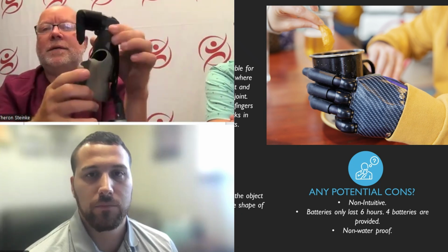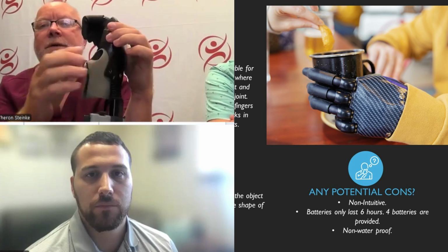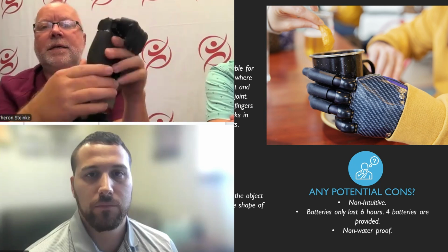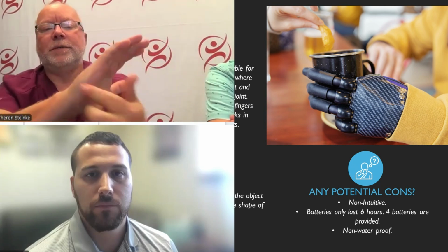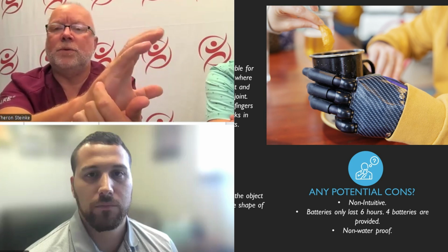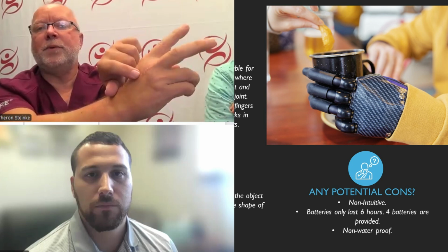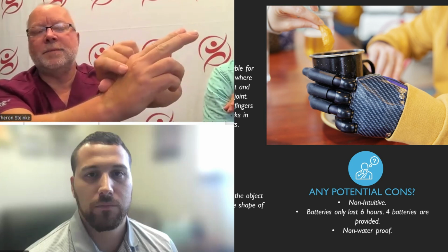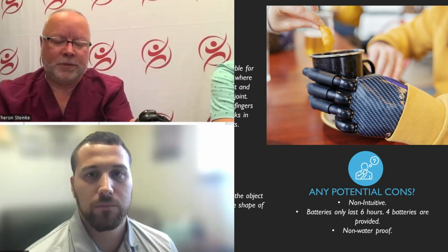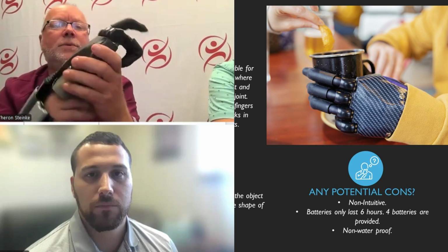This patient still had their thumb, and this would be just a strap that would run across here. And the way that they would activate this device is the electrodes are going to be right here. And when they do pinky down, that's going to close the fingers. And then the other electrodes would be right here. When they bring these two together, it activates this muscle, and that's what opens the hand. Okay, so I can demonstrate this thing working here. And this is something that's connected to a laptop.